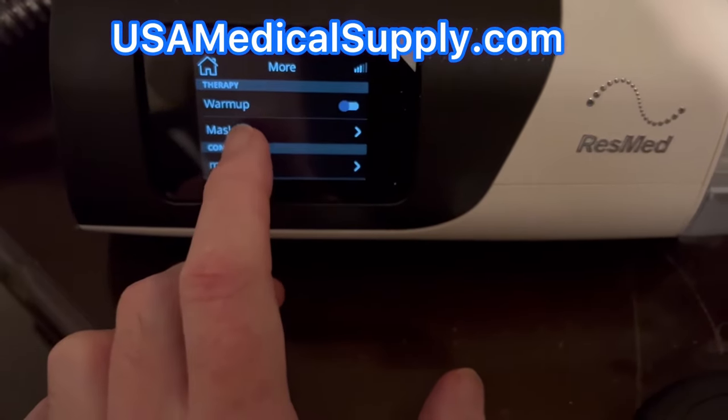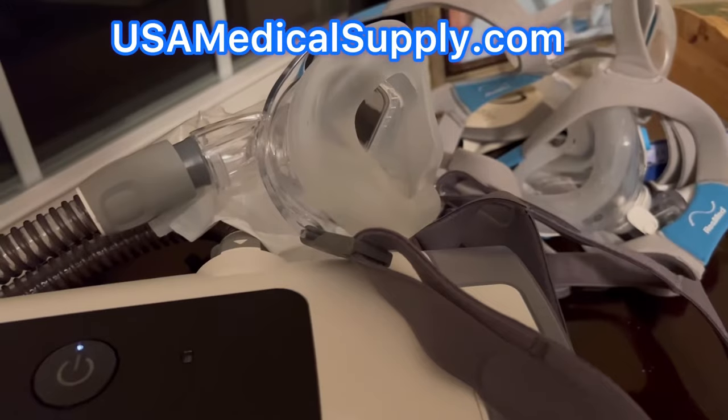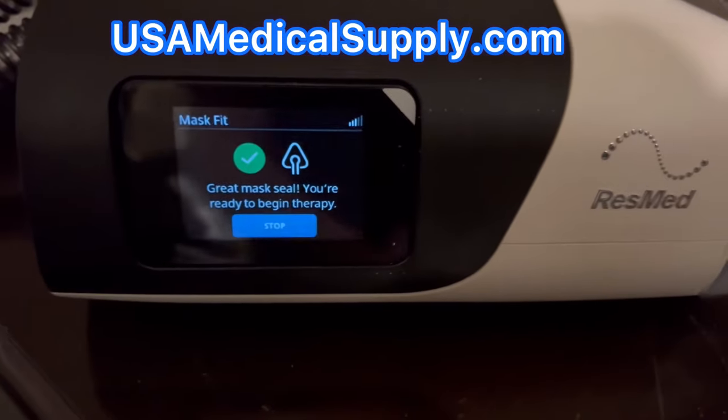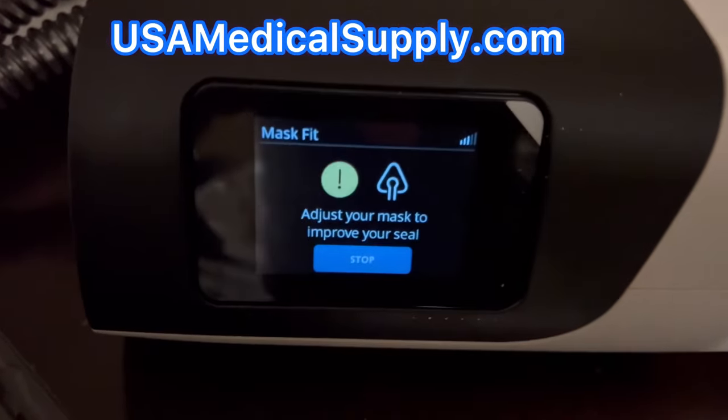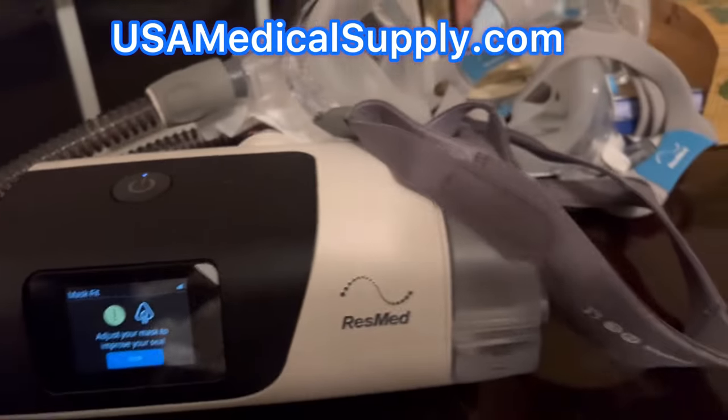All you're going to do is hit that plus sign and select MaskFit. I'm going to press start with the mask off just to show you what a leak looks like. You're going to see the green check mark turn into an exclamation mark — that means there is a high leak.